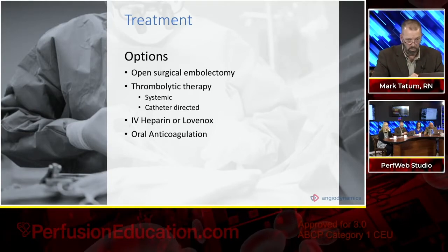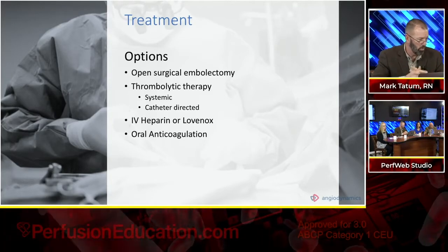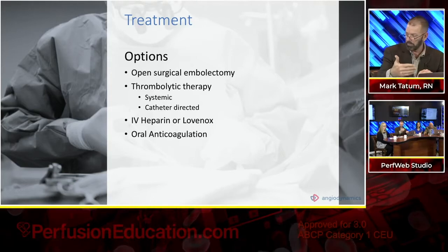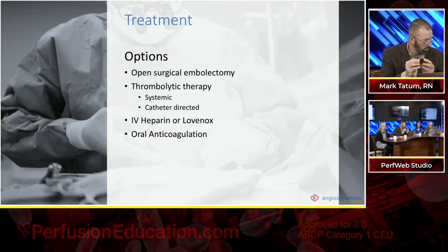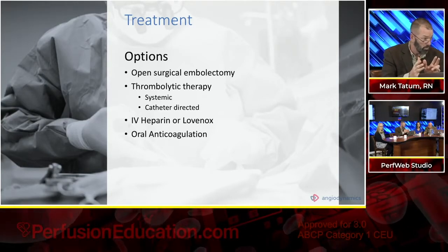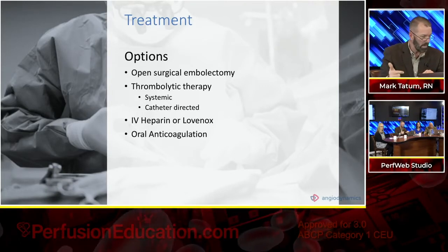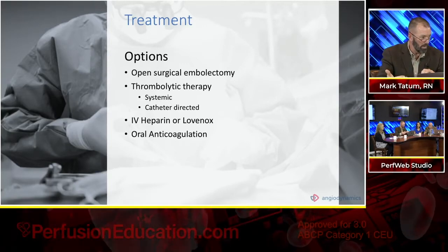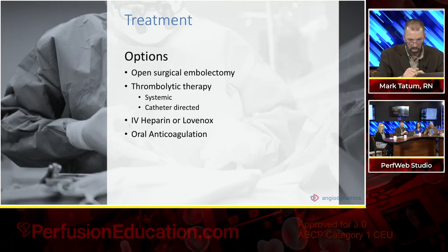Next, it's going to show thrombolytic therapy. There are catheters on the market today that are approved for placement within the pulmonary vasculature. Giving lytics to a specific area reduces your chance for major complications from 10 to 15% with systemic to 1 to 3% with catheter directed. And you don't have, I don't think, as great a worry with some of the relative, not absolute, but relative contraindications that you may have to lytic therapy otherwise.